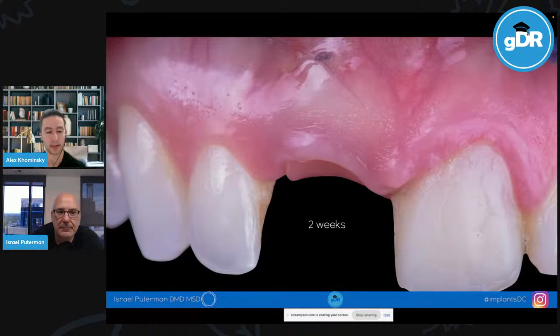And are they leaving with like a removable retainer or a partial plate? Do you have preferences? Yeah, so I only make Essex retainers. I do not make stay plates or flippers or whatever you'd like to call them. As a periodontist, I hate adjusting them. I'm changing the contour of the facial margin. I'm even changing the contour of the palatal margin. That little customized healing abutment does slightly change the contour of the palatal tissue. I don't want to thin that area so much that it can break. I don't want to be responsible for that.